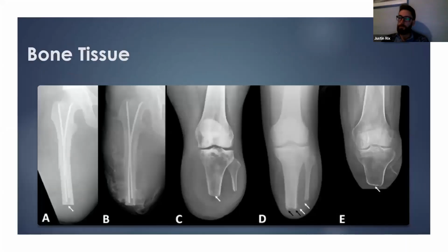And again, going to bone tissue. This is what Jason spoke about, talking about beveling the bone. Proper foresight and attention to bone preparation can eliminate potential areas of high pressure of the bone against the socket. For a below-knee amputee, a common site of discomfort and skin breakdown is the distal anterior aspect of the tibia. This is because the tibia helps drive the prosthesis forward. And this is often due to inadequate contouring or beveling of the tibia at the time of the amputation.